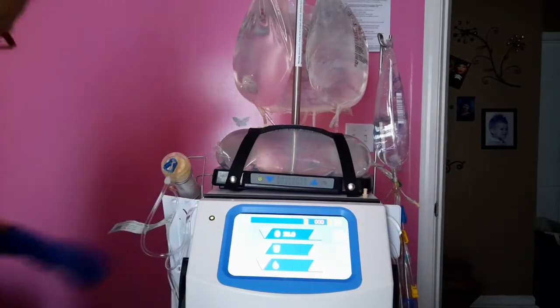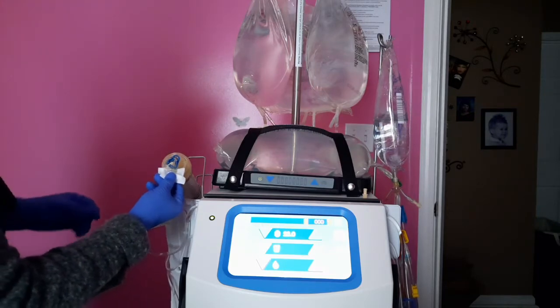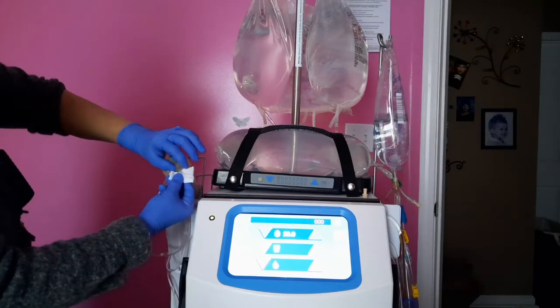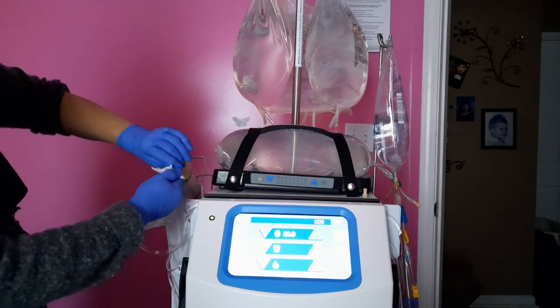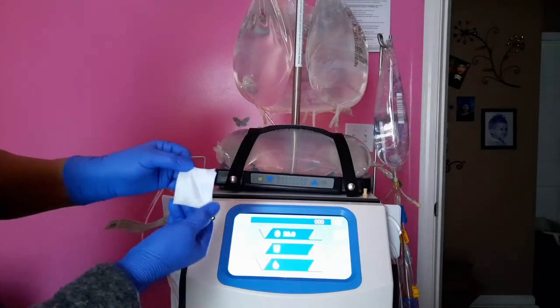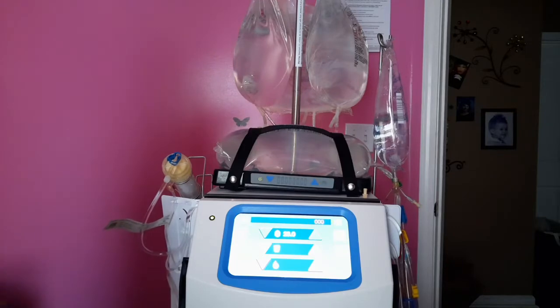So what we're going to do is take a gauze and put it over the cap. All right, hold on to the wings and loosen the cap until you see that air coming out of it. You'll see the fluid, and then you close it right back. Just a little bit came out onto the gauze, not much. But you want to hold the gauze in there because the fluid detection sensor is on the bottom, and if just a drop touches it, she'll start screaming.